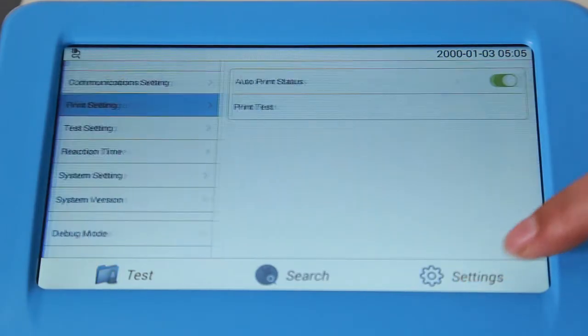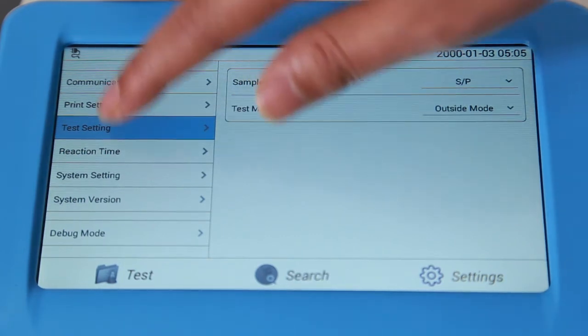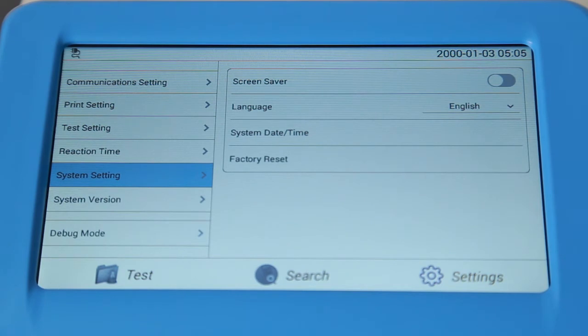Communication Setting is used to set the COM status and to test whether the barcode scanner is working properly. Settings of Sample and Reaction Mode can be done on the test settings interface. Reaction Time Interface is designed to set the display time of each test item — normally it is set at the factory. System Setting Interface is designed to set screen saver, language, date, time, and restore factory settings.